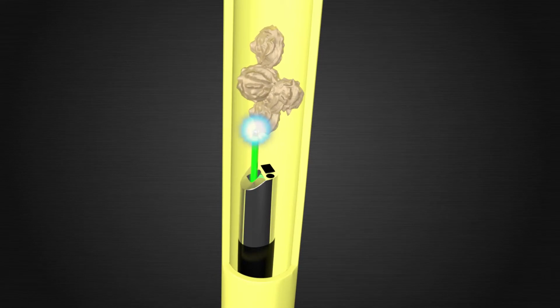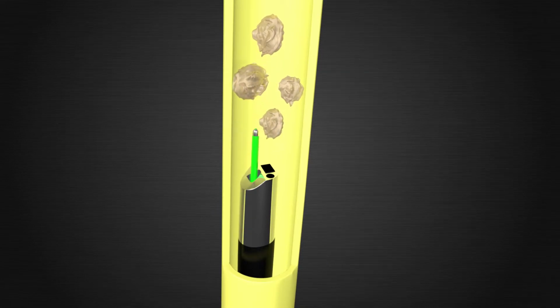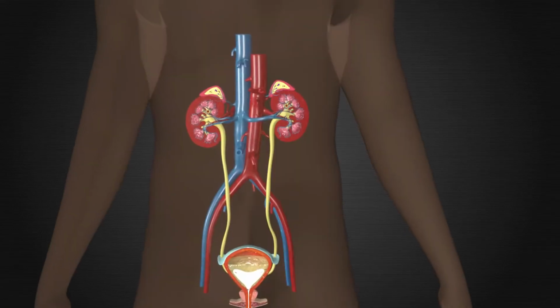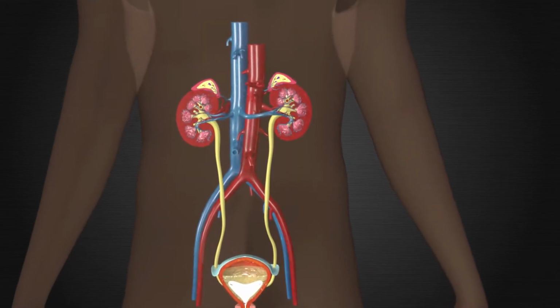Once we find the stone, we will use a laser to either break it into several smaller pieces, a technique known as fragmentation, or to turn it into a fine sand, a technique known as dusting. If there are several pieces, we will use a small basket fed through our scope to pull them out one at a time. In some cases, your stone may be small enough to remove with the basket without using the laser at all. Once we believe we have removed the stone, we will take another look in your kidney to make sure we didn't leave any pieces behind.